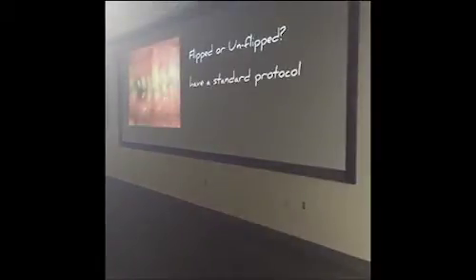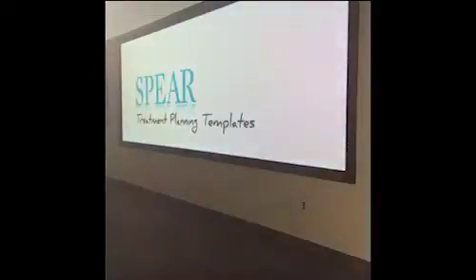Do you save them flipped or unflipped? Doesn't really matter. If you've taken mirror shots, just have a protocol. My protocol is always to save them in my database the way they were taken. So all of my occlusal shots are going to be upside down. All of my side shots are going to be flipped and need to be flipped horizontally. So although that looks like a nice picture, that's actually what the patient is. I know that because I know I always store them that way.